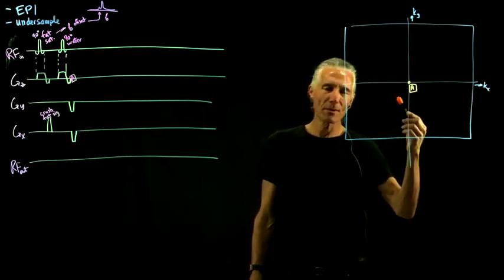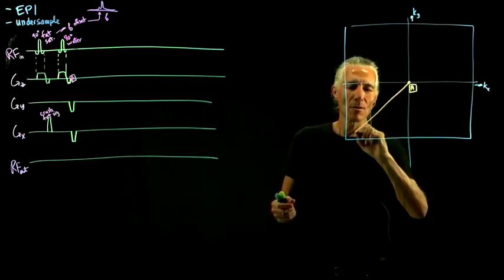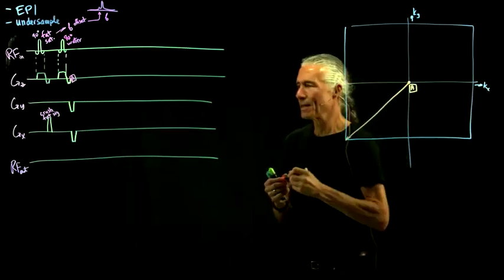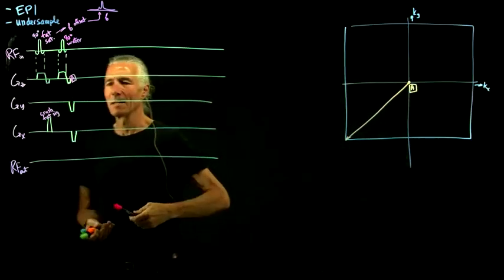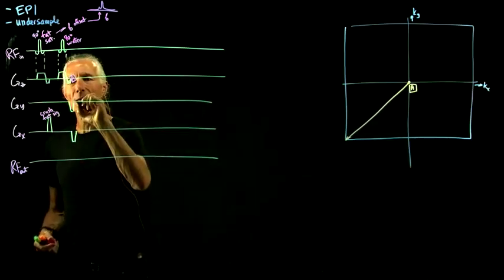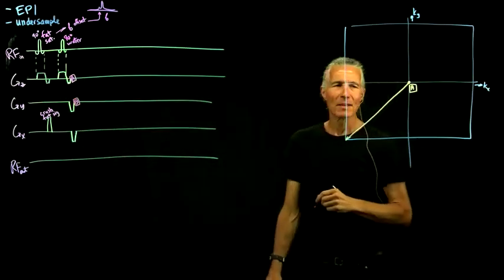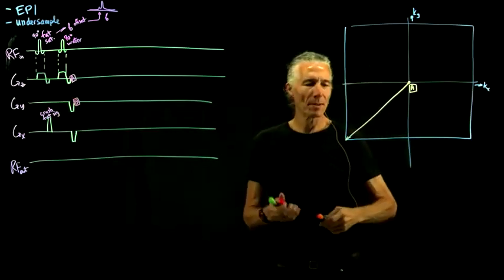If you put those both together, you get diagonal stripes. And so you'll head down to the corner of K space like that. By the time you get down there, you're at point B. To save time, those are usually done at the same time, but you can conceptually think of them as different. And so then we end up at point B.